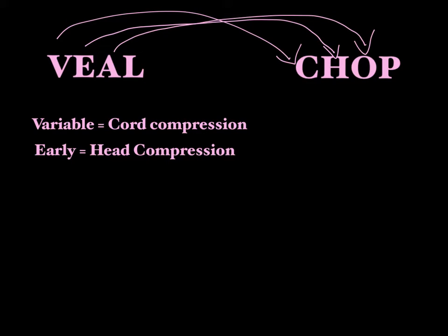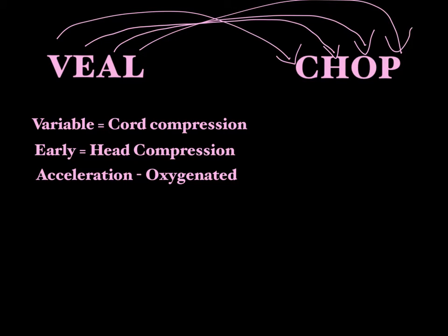Goes with the O, and that is for oxygen. So acceleration means the baby is oxygenated. See how this is working? It's just perfect. Okay. And then our last one is L, lates. And lates are from placental insufficiency. Okay?